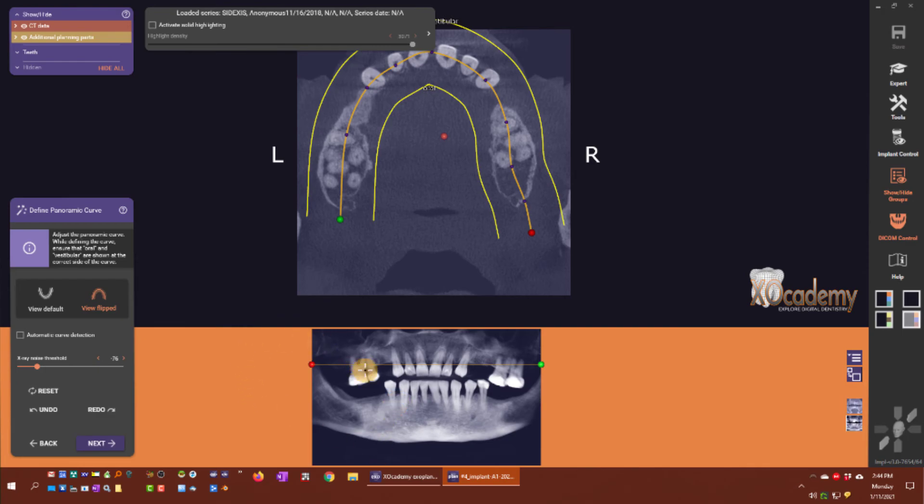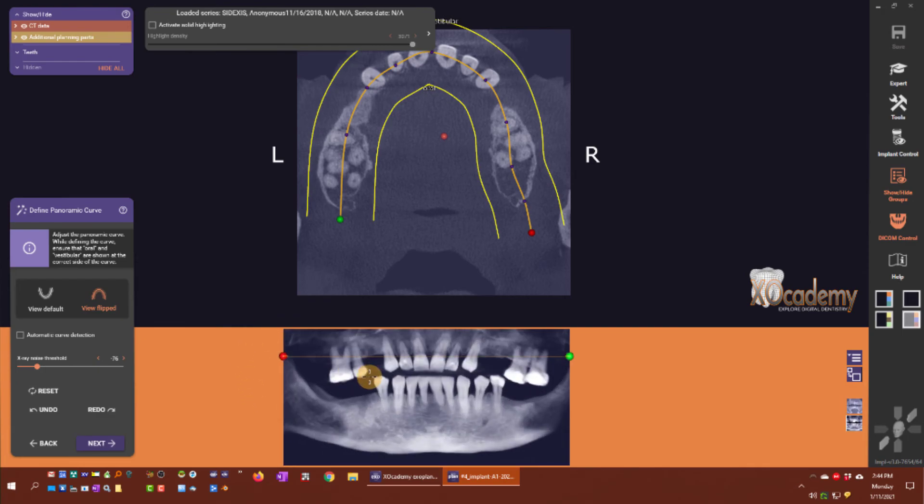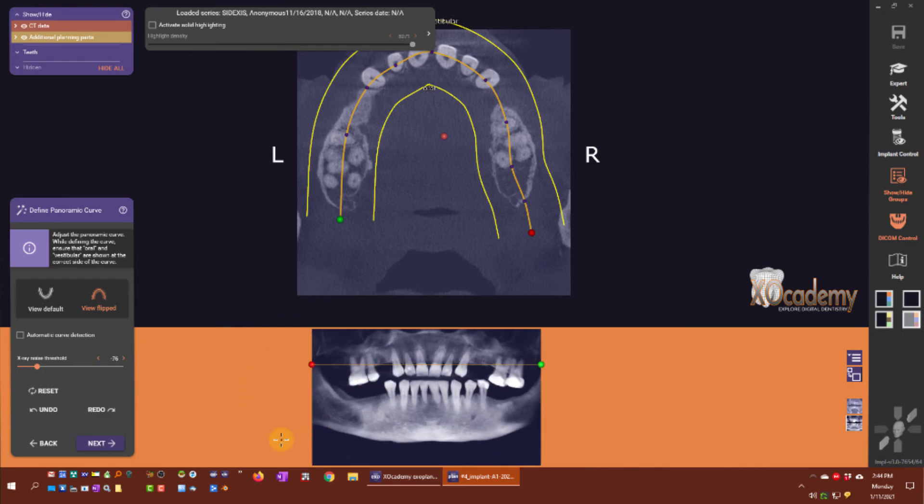That finishes defining the panoramic curve.